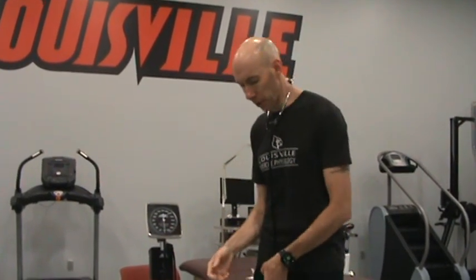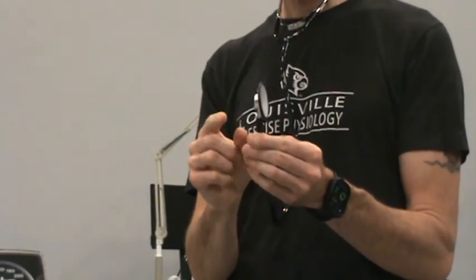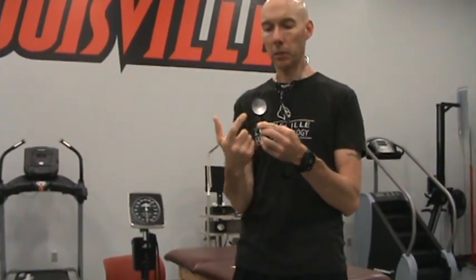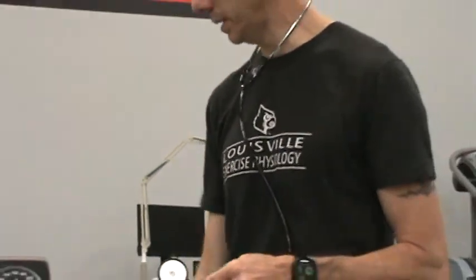And hearing really is one of the hardest things with blood pressure assessment. You're going to be listening for what sounds like a pulse, and the better you can hear, the more accurate your blood pressure assessment skills will be. And we also want to make sure that some stethoscopes have a large and a small bell, and the small bell is for measuring blood pressure or heart rate on infants. In this case, there's only one bell, so I don't have to worry about that. If there were two bells, I would want to make sure it's twisted one way or the other. On my large side, I would tap on it, make sure I could hear the noise, and then I would know I could hear the sounds appropriately.